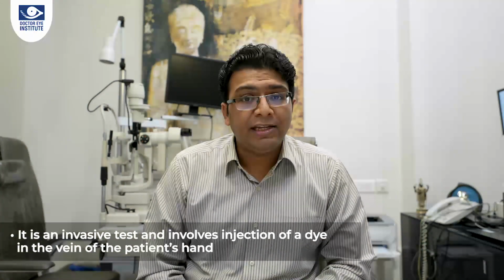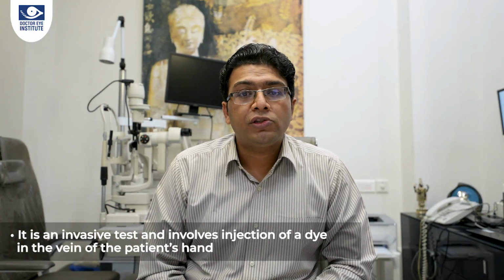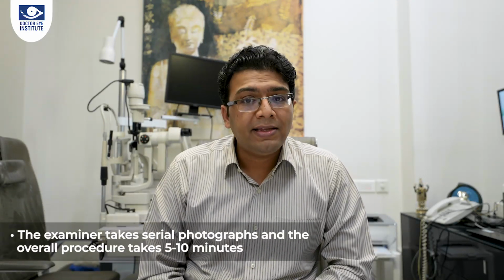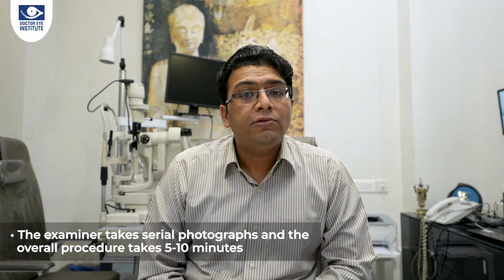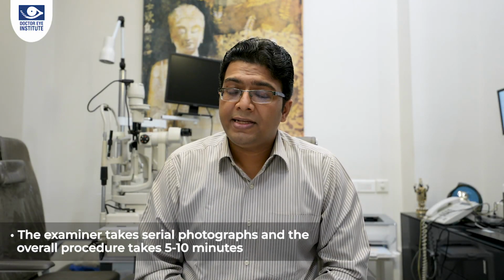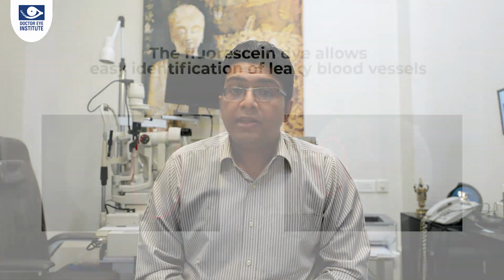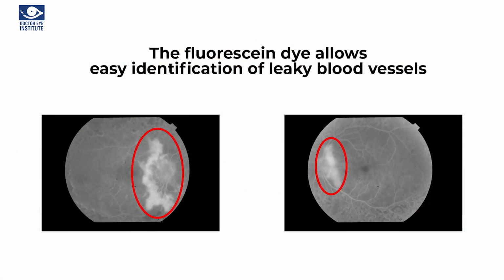It involves the injection of a dye called sodium fluorescein in the veins of the hand. The patient places his chin on the chin rest of the machine, while the examiner takes serial photographs of the retina using specialized filters. The test typically requires only 5 to 10 minutes. The new blood vessels, being leaky, leak the fluorescein dye, allowing their easy identification.